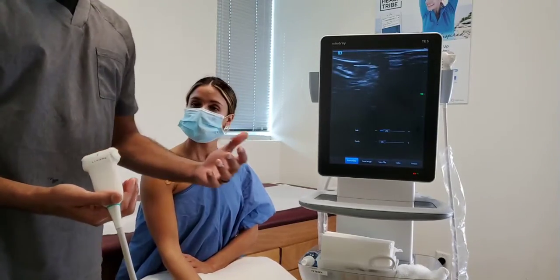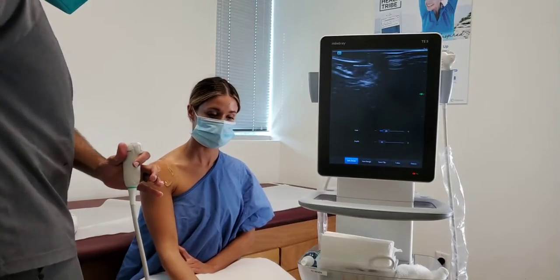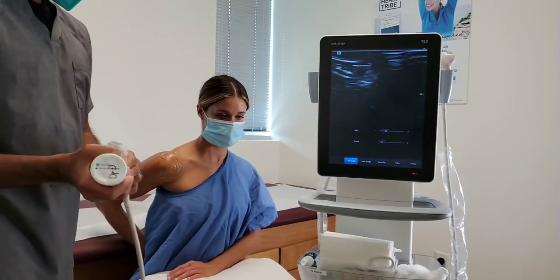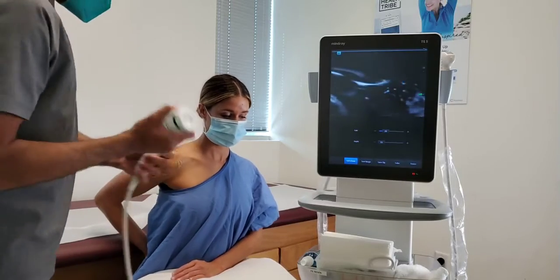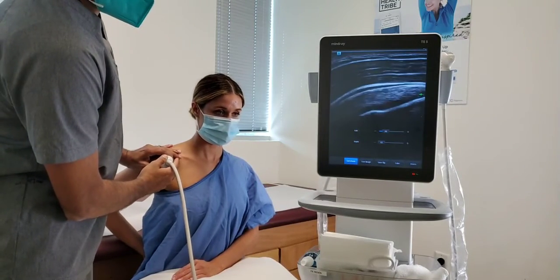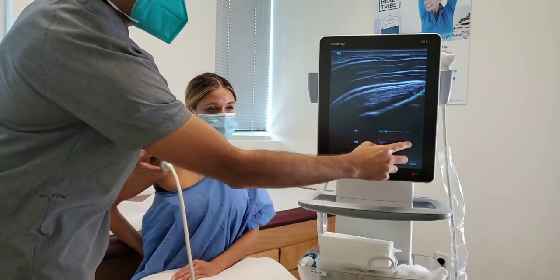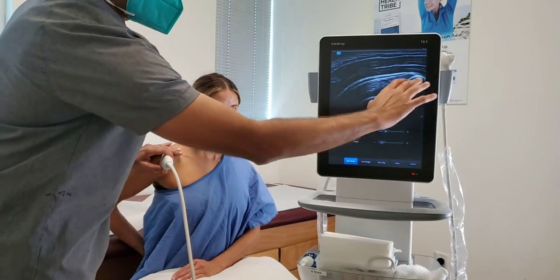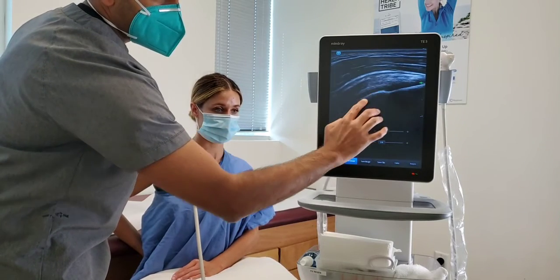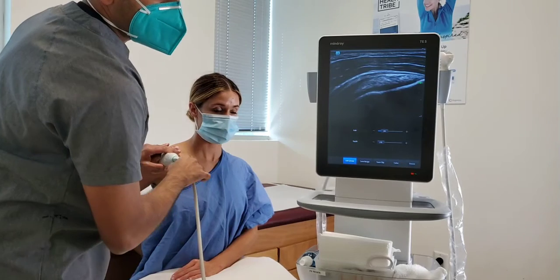Now we're going to look at the major part of the rotator cuff, which is called the supraspinatus. So I'm going to have you put your hand on your butt like you're reaching for your back pocket, just like that. And now we're going to look at the supraspinatus tendon, and that's this tendon coming across there. Again, here's your arm bone, your humerus, and here are your tendon fibers going across, somewhat parallel, all the way across and attaching there.